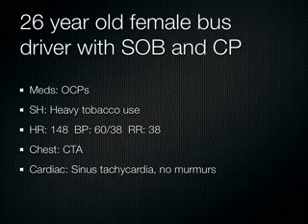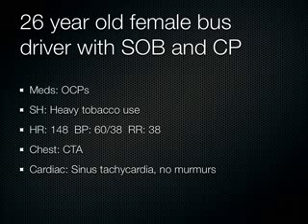So I actually had the nurse get the thrombolytics out for this patient, and the father's asking me, well, are you sure it's a blood clot in the lung? I said, well, yeah, clinically, I really think that's what's going on. How do you diagnose it? A CAT scan, but we can't put her in a CAT scan. He was like, well, is there anything else you can do? And then I was like, oh, yeah, I can do an ultrasound. And so I brought the ultrasound machine over, and I did this.